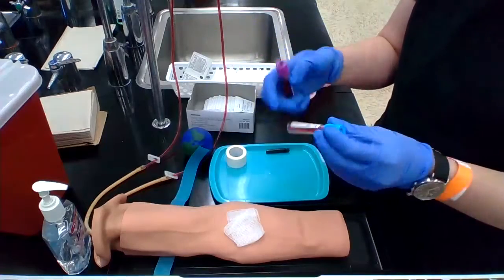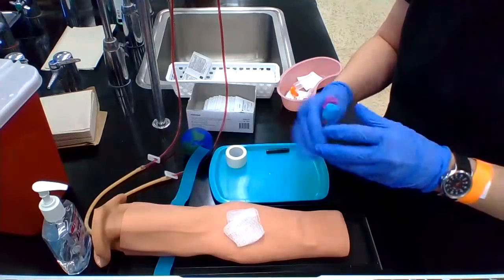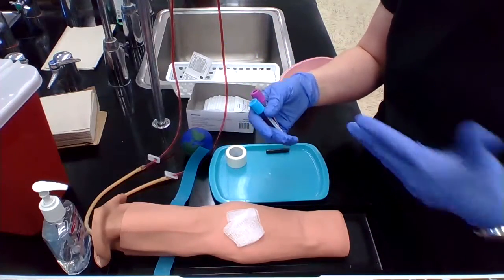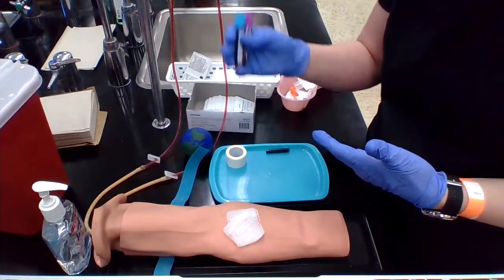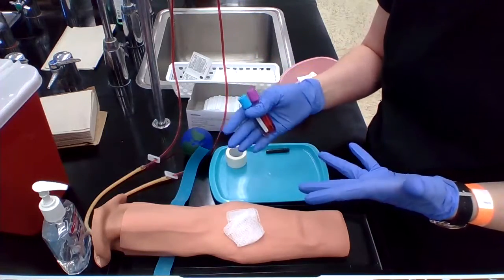When you label the tube, ask the patient to confirm — always confirm. Then you're going to send the sample: you might be doing testing right there at your clinic lab, or you might be sending it off to a different lab. They're going to want it in a biohazard bag with the lab requisition.